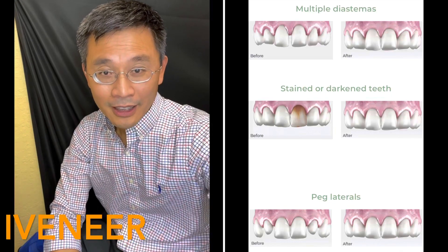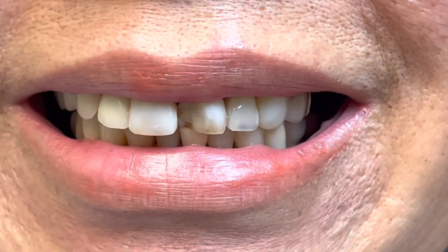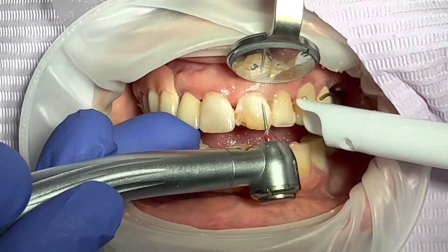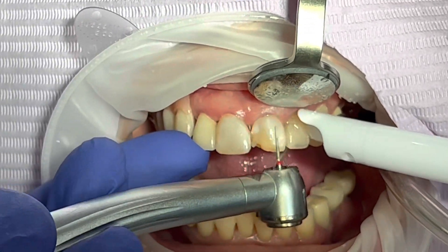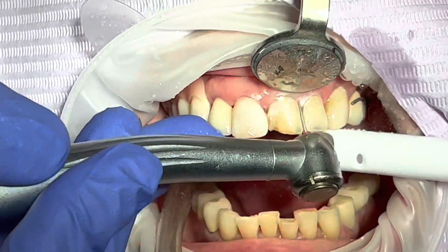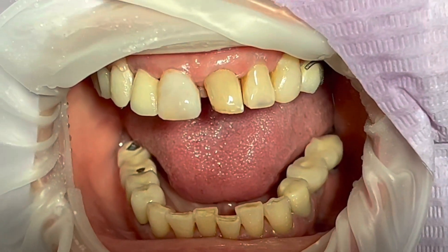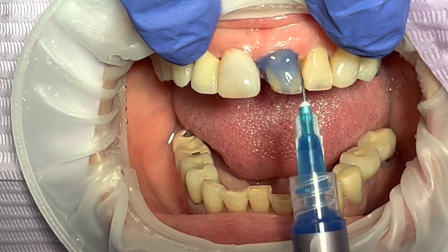Let's jump right in on this case. The patient came in with a broken tooth with broken composite and an old veneer. I typically would numb the patient, but in this case I did not have to — I told her if she feels anything and needs anesthesia to let me know. I went ahead and removed the material. It's supposed to be a non-invasive procedure, but because the patient had so much artificial composite material, I had to remove it all and clean everything down to the enamel.